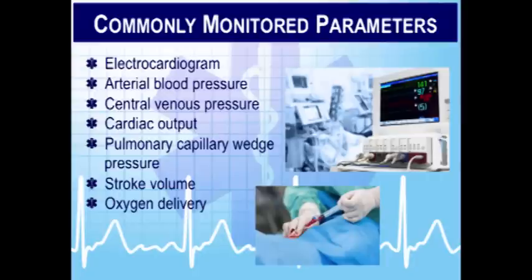You're bouncing down the highway, you can get a blood pressure reading on a dead person, right? Sometimes it'll only display the mean pressure. It won't give you a systolic or a diastolic. Well, what does all that stuff mean? We can sort of talk about that here.